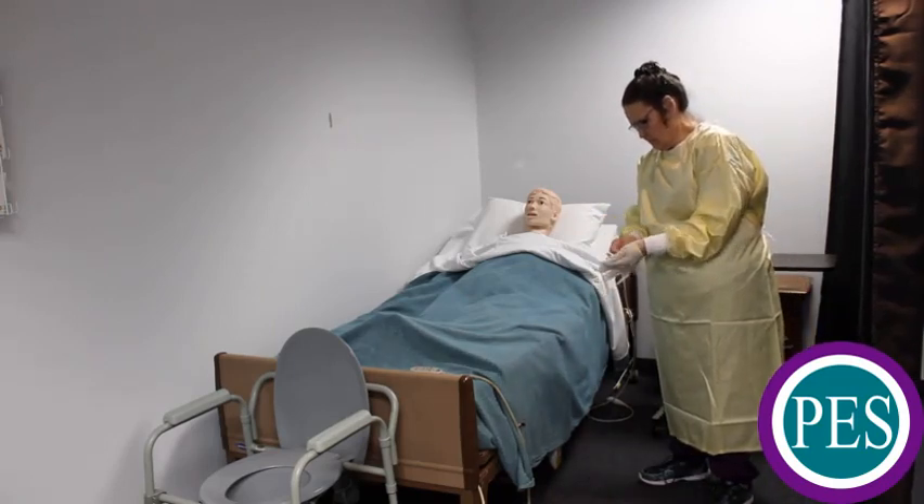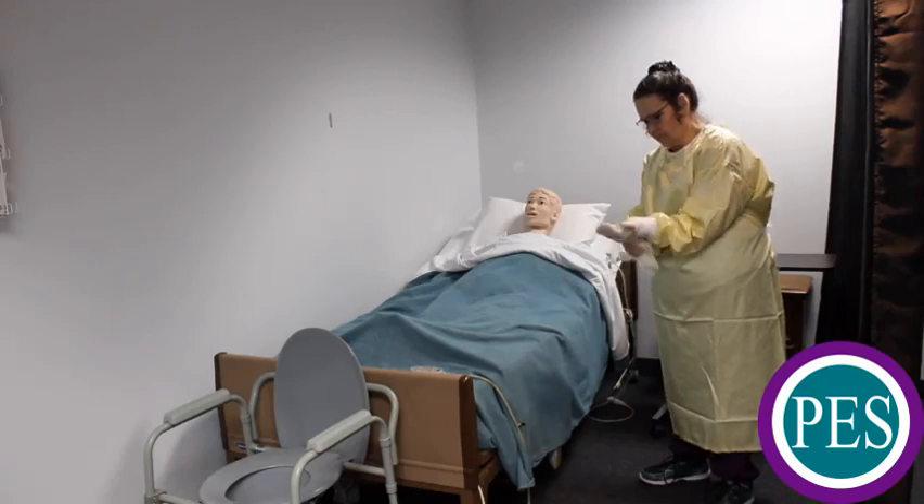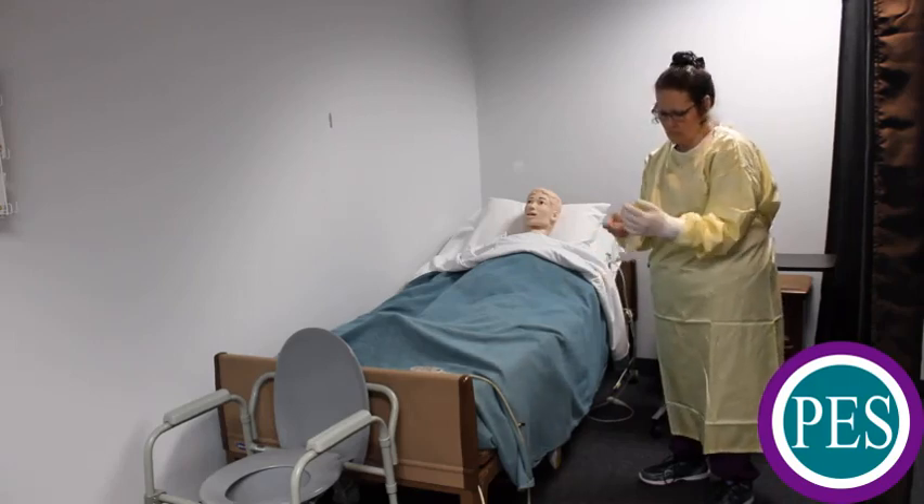Put on your gloves and ensure that the cuffs of the glove overlap the cuffs of the gown.